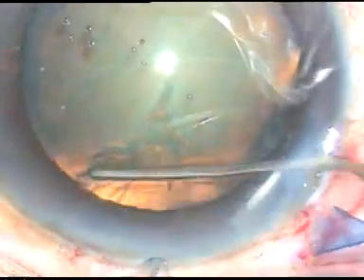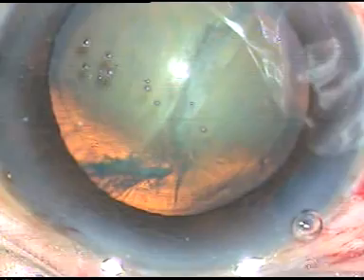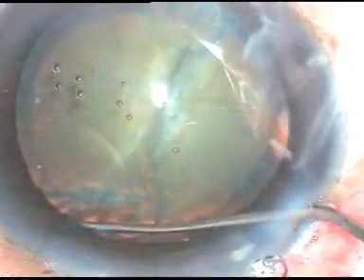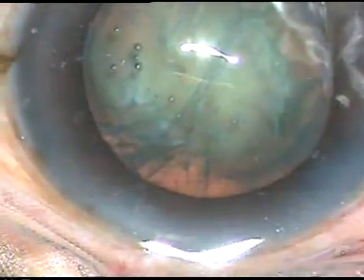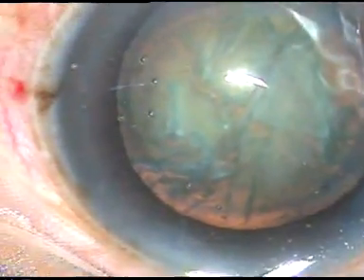I go to the equator of the capsular bag and inject fluid. Now the nucleus is depressed with some more hydrodissection, and I see that the nucleus is mobile — that's it.